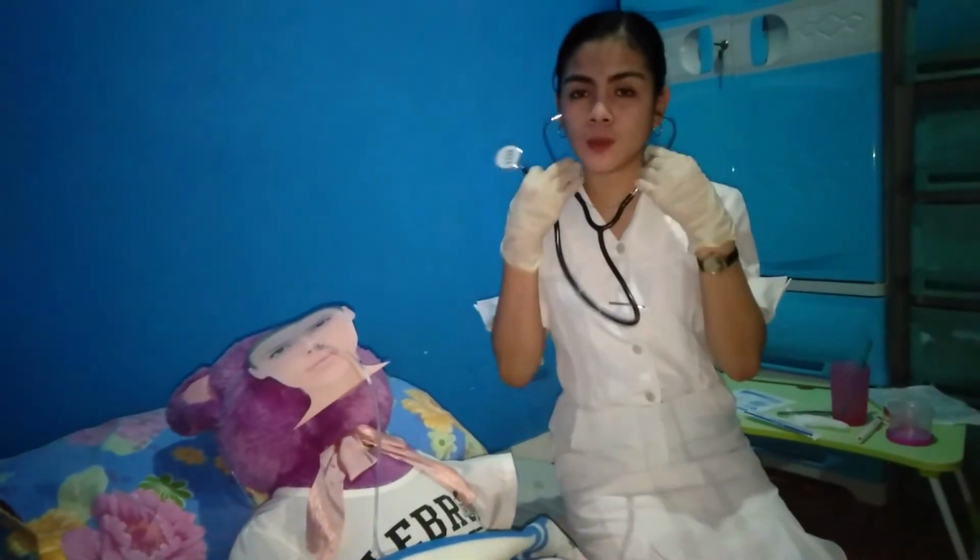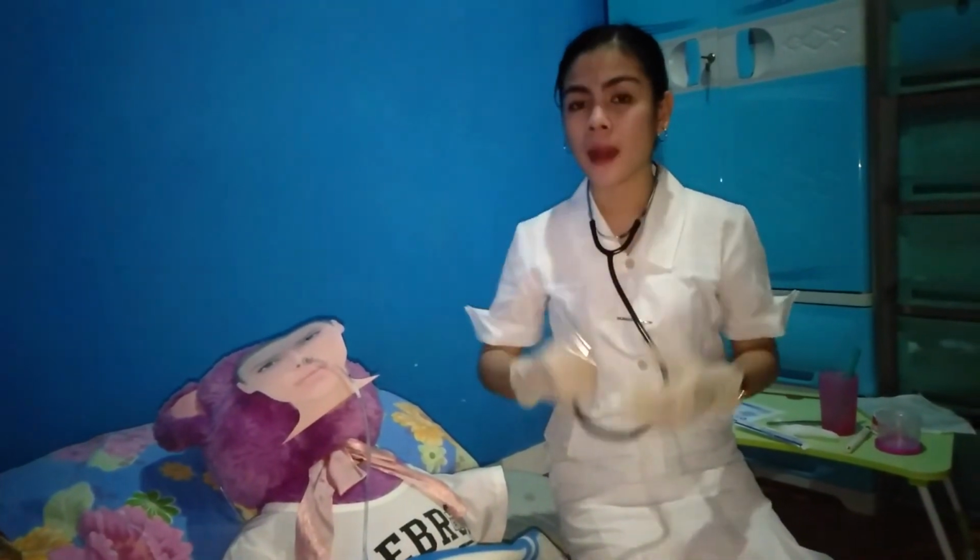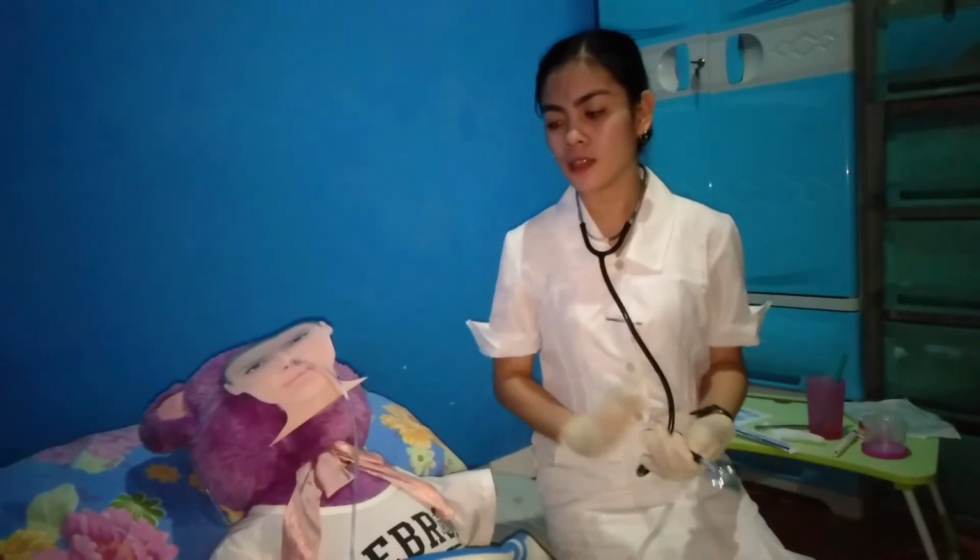Okay, hearing the whooshing sound in the client's stomach means proper placement of the tube. Then next, we may need to secure the tube by taping it to the bridge of the client's nose and anchor it as possible.